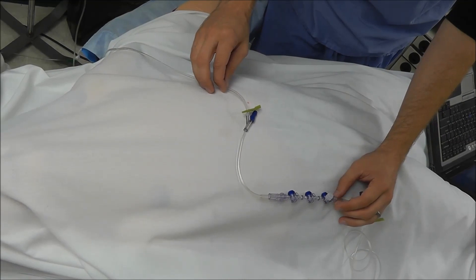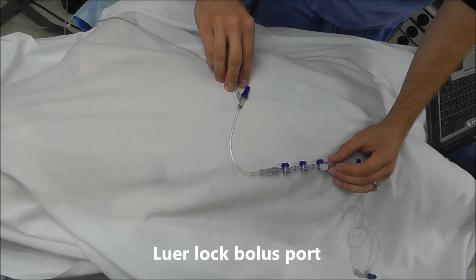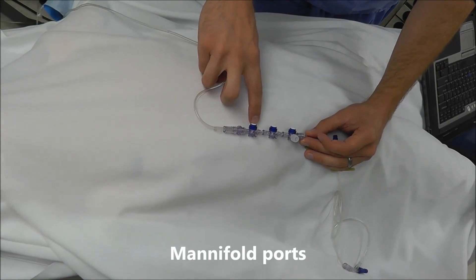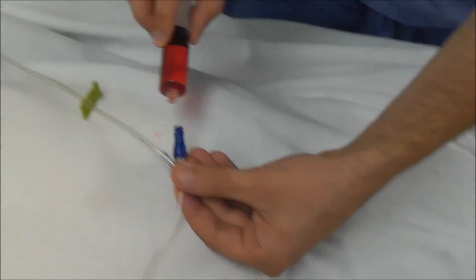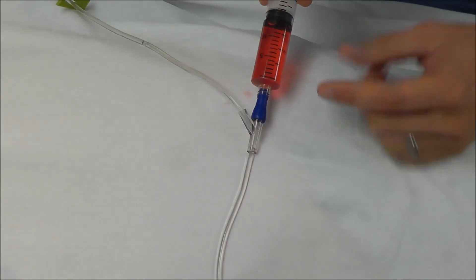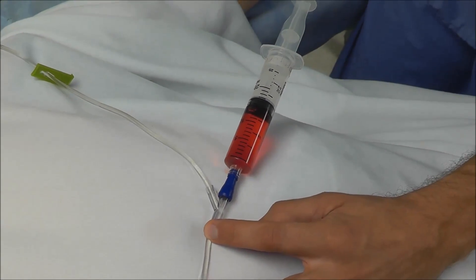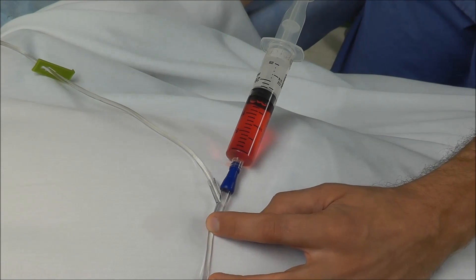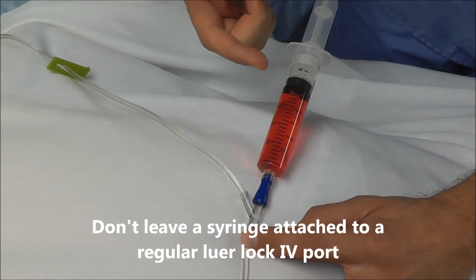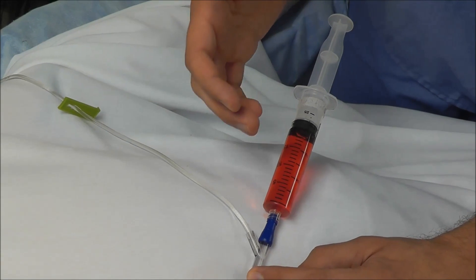The next thing to notice on IV tubing is the types of ports you can inject into. We have a regular luer lock port, and we also have manifold ports. With a regular luer lock IV port there are no one-way valves, which means fluid can actually back up into the syringe. When the IV tubing is running, you can see fluid backing up into the syringe and diluting the drug — so you would never want to leave a syringe attached to a regular luer lock port, otherwise your drug could become diluted.